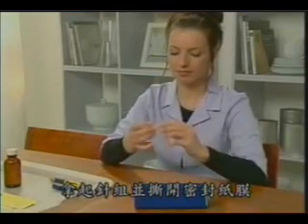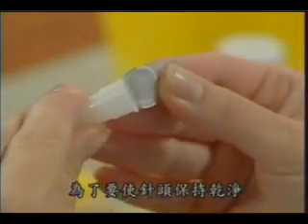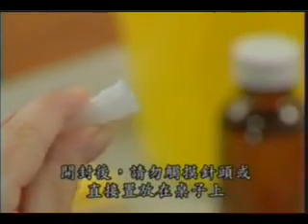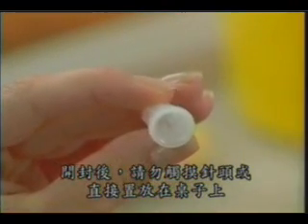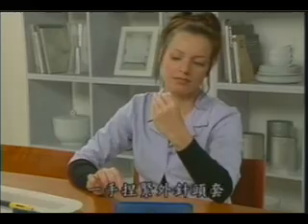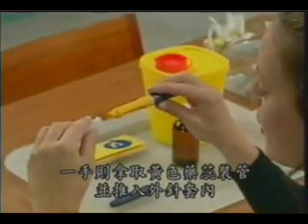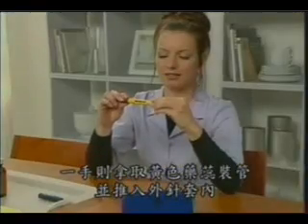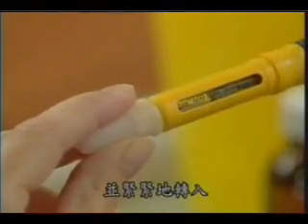Take the needle and remove the protective paper seal. To keep the open needle clean, do not touch the exposed needle or place an open needle unit on the table surface, but proceed directly to the next step. Hold the outer needle shield firmly and push the end of the yellow cartridge holder into the outer needle shield. Screw on securely.